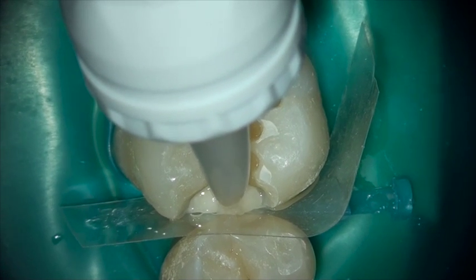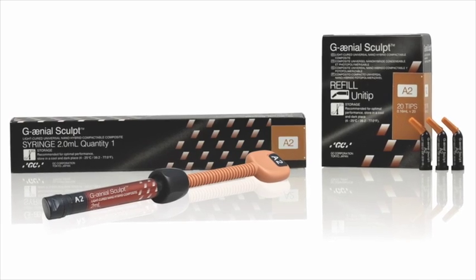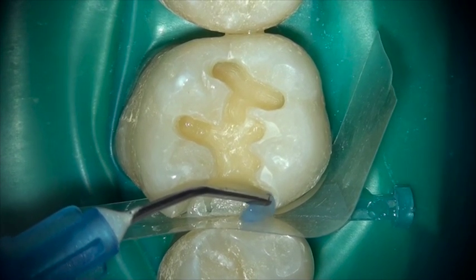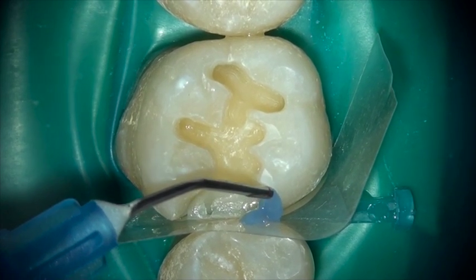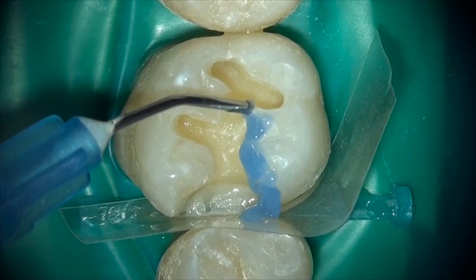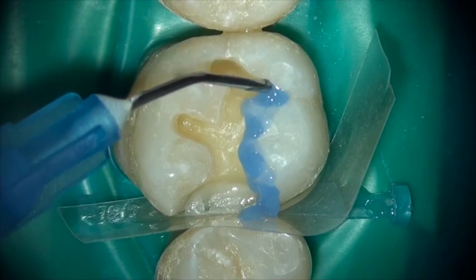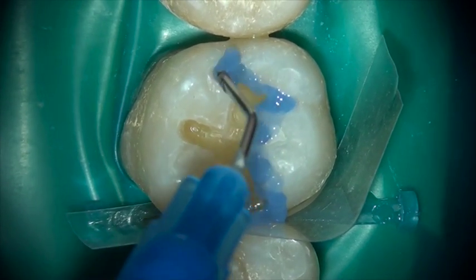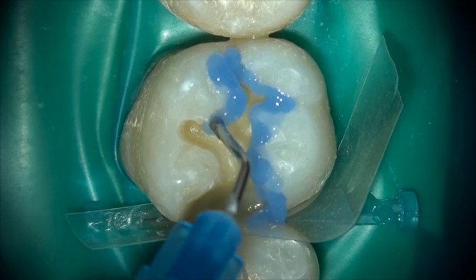We're going to use Genial Sculpt. It is a spherical nano-hybrid particle, specially coated — silanated coated spheres within the composite — that makes this an absolutely wonderful, sculptable, self-polishing, highly aesthetic composite restorative material with wonderful physical properties.